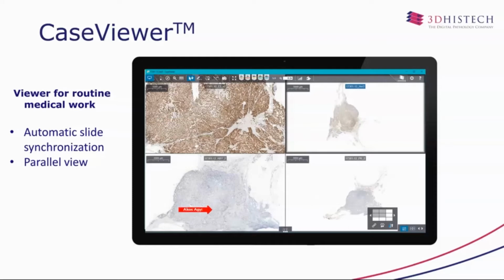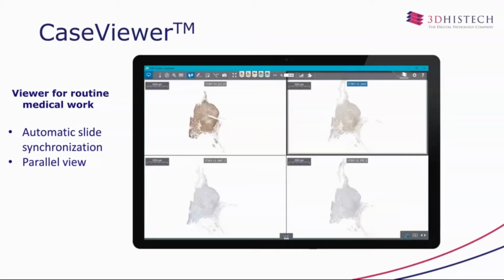In this viewer software, after opening them, you just need to click on the automated rotation button, and the software automatically rotates them into the same orientation and also brings them into the same zoom level.